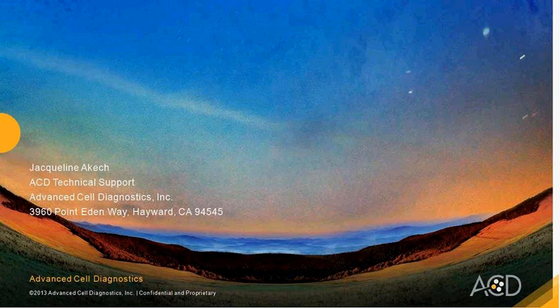I have another question that tends to come in support. That question is, why do I need EcoMount and SuperFrost Plus slides? For EcoMount, this is specific for those who are using 2.0 red and 2-plex assays. What we've seen is when you use other mounting medium, you will notice diffusion. So we recommend that you use EcoMount at all times if you're using both 2.0 red and 2-plex assays.